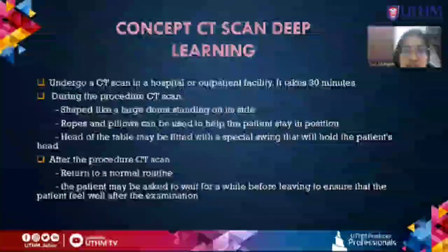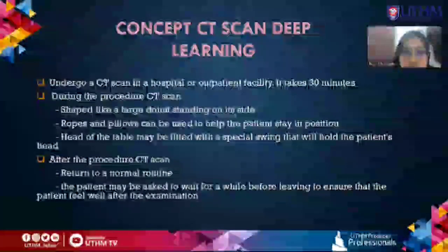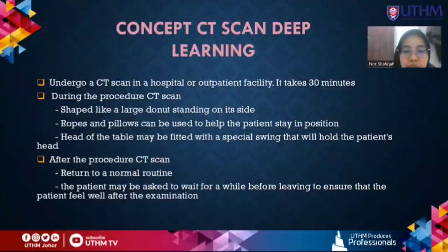Next is the concept of CT scan deep learning. The concept of CT scan, which is related to deep learning, is that we can undergo a CT scan in a hospital or outpatient facility. The CT scan is usually not painful and the machine only takes a few minutes. For the whole process, this usually takes 30 minutes.